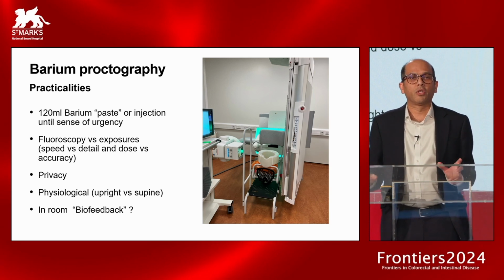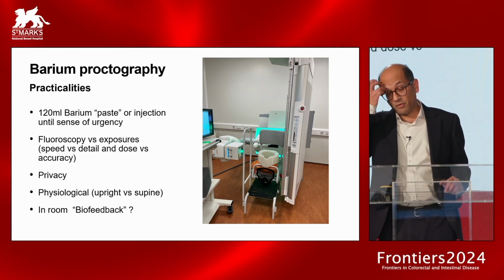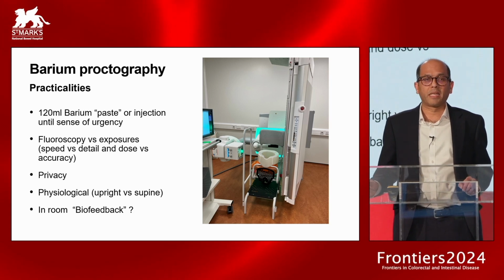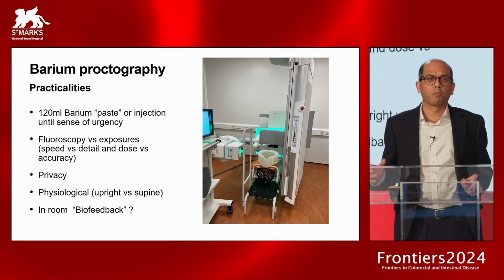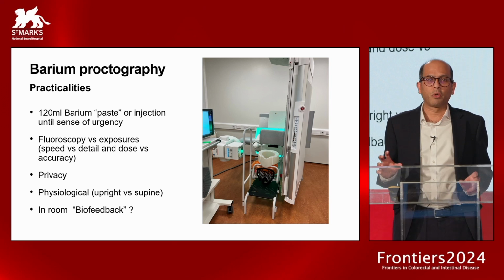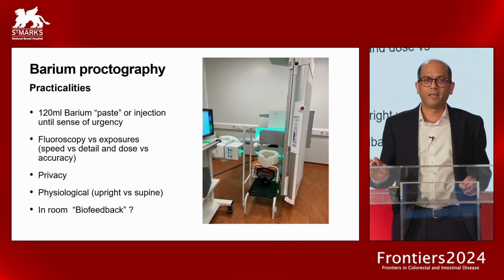The other thing, just to explain, is that there's a difference between two ways that certainly in the UK centres will either do what we describe as fluoroscopy. So in other words, you don't take actual exposures, but you have continuous fluoroscopy. But then sometimes there's advantage and disadvantage of both the technique of just doing so-called fluoroscopy and capturing a continuous video loop effectively, and individual exposure.